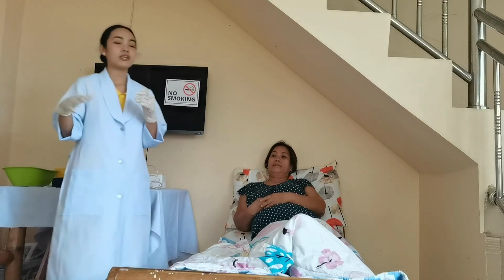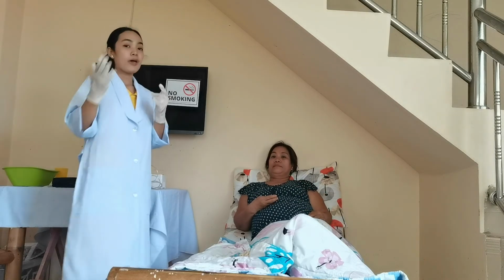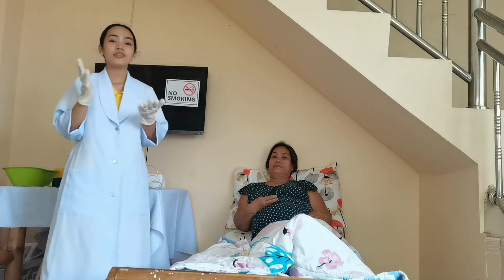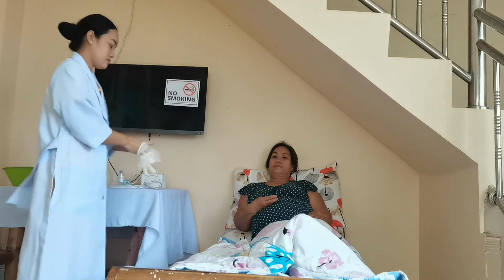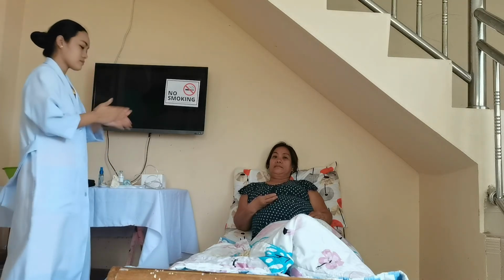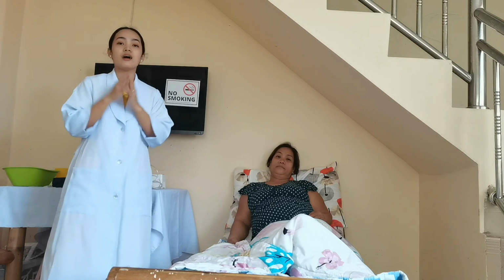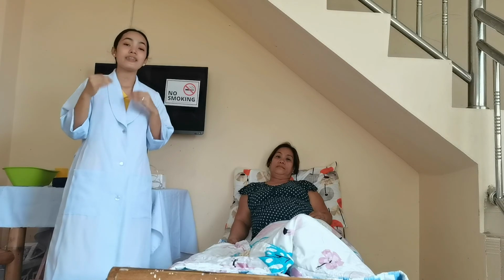And then after having the patient gargle, we will clean the nebulizer depending on the manufacturer's direction. So once we are done cleaning the nebulizer, we will now remove PPE if used and perform hand hygiene. So after this, we have to document the procedure right after the administration of the medication to ensure that we have already done the procedure and it is written.